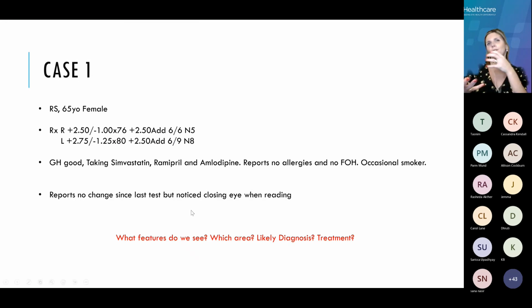Okay, so I've just got a couple of cases just to go through. I think I'm still doing okay for time. So these will just help you really just to have a little bit of an indication. They're nothing too much, but it just means that they're things that you may start to see in your interpretation when you're in clinics or when you're starting to get this information come in for your patients.